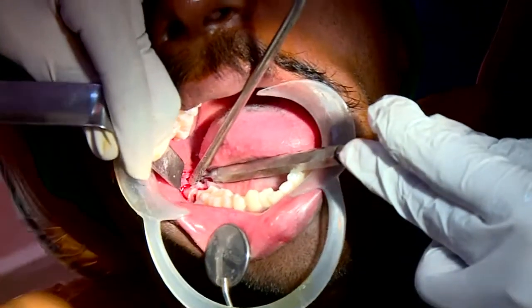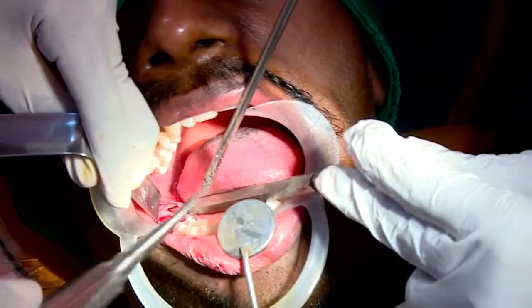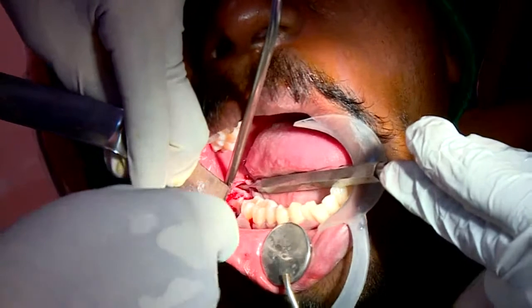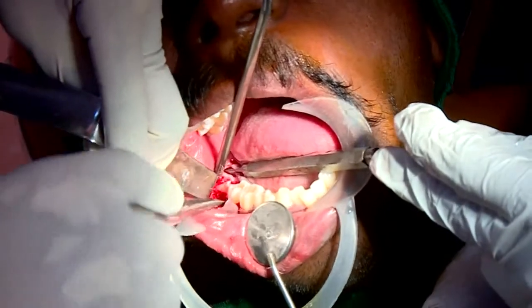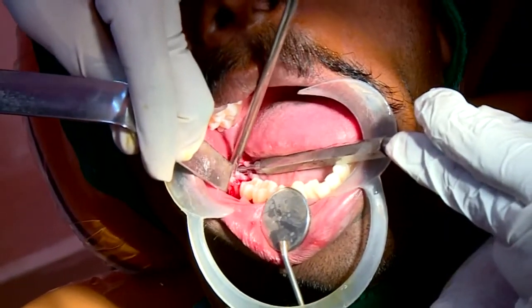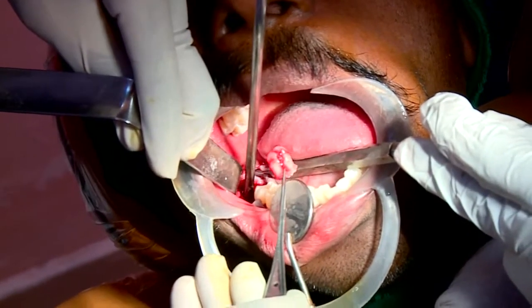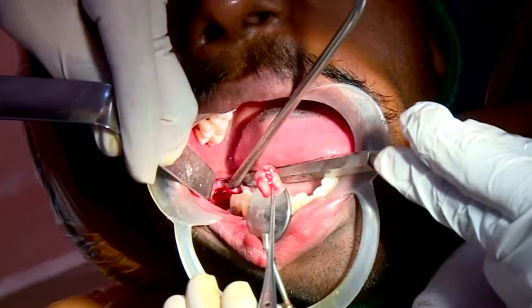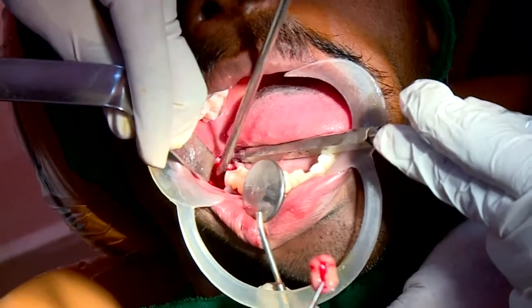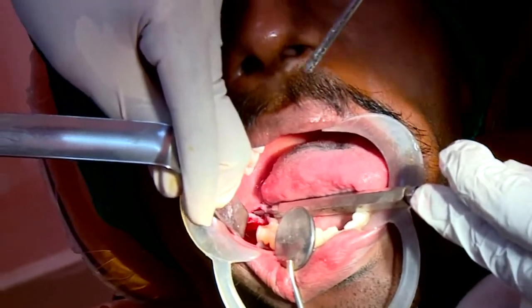Again, without too much force, you can try to elevate it into the space. Now sir is elevating it into the space created by the removal of the crown. The crown is divided into 3 pieces, sir, and the entire root segment is removed. It looks more bulbous in the apical region. So it is only removing the crown portion.